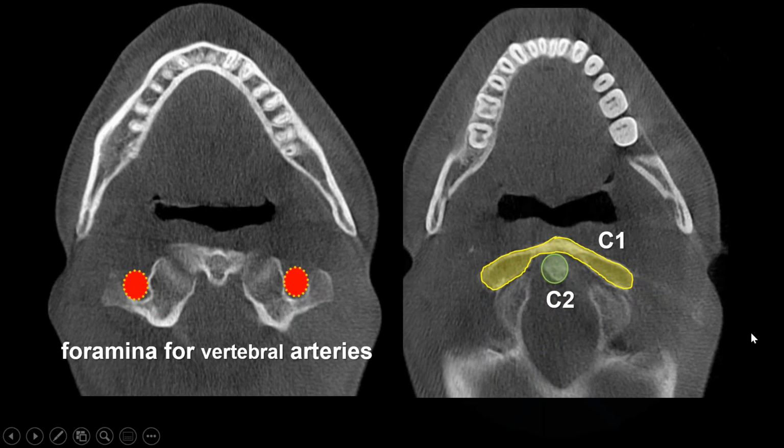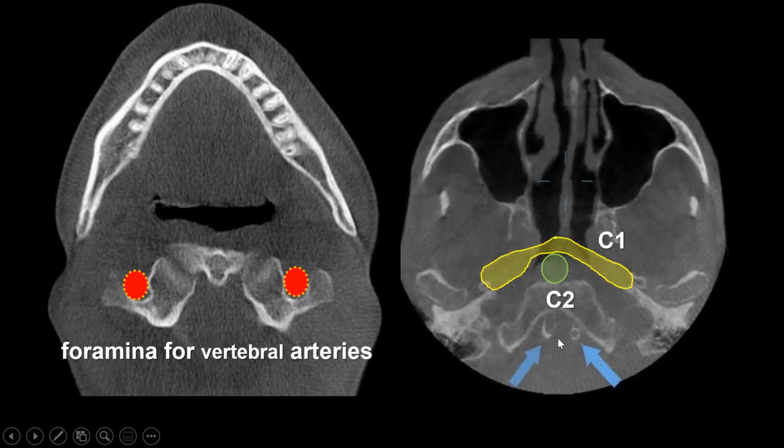Because periodically in that region, I'll see things like this. These are actually vessels. These are vertebral arteries that have calcification around the medial layer, not the tunica intima, not intimal plaques, but calcifications in the muscular layer or the medial layer. This is a diabetic or someone with kidney disease or any of those other comorbidities. And if you've not been introduced to it, you're never going to find it. You'll look at it, go, that's probably just normal, and skip on from there.